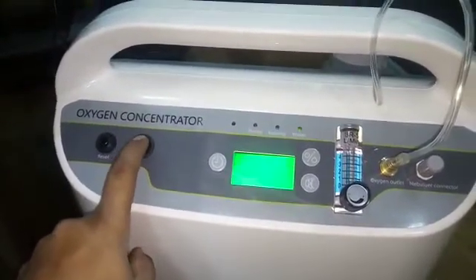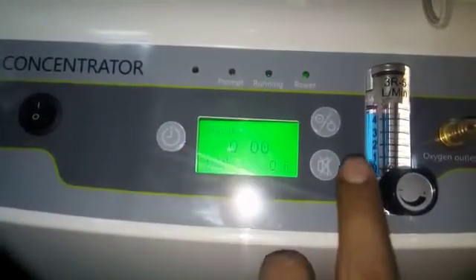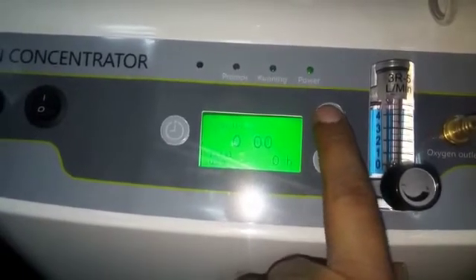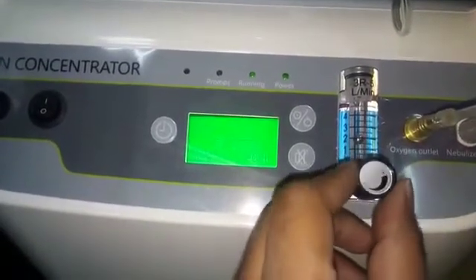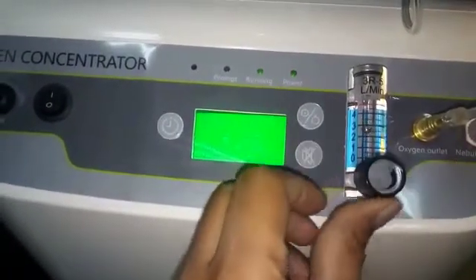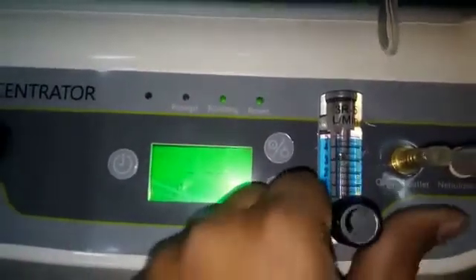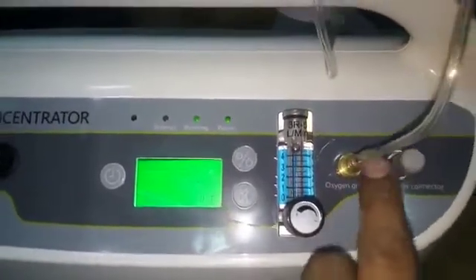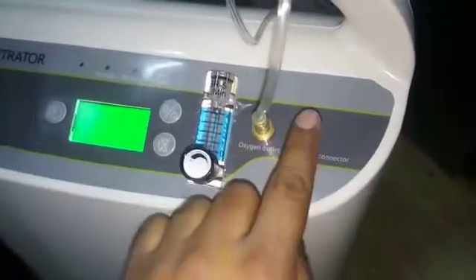This is the on/off switch. This is in standby mode. Please press the on switch. You can see this dial to adjust oxygen flow, 0 to 5 liters per minute. This is the way to the humidifier bottle, and this port is for the patient. This is a humidifier bottle, and this port is for the nebulizer.